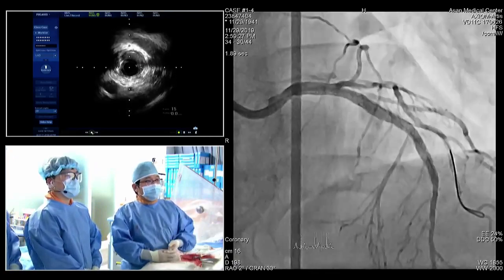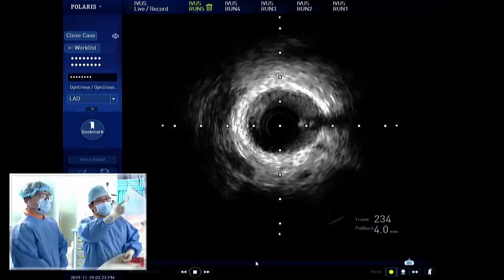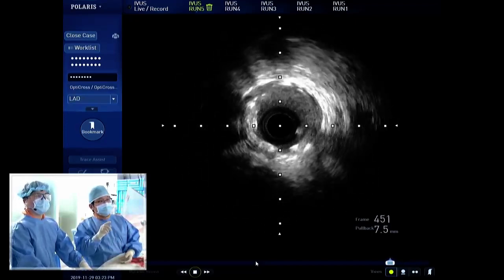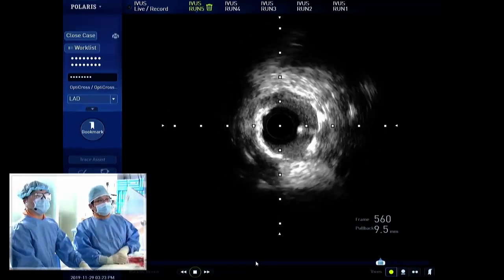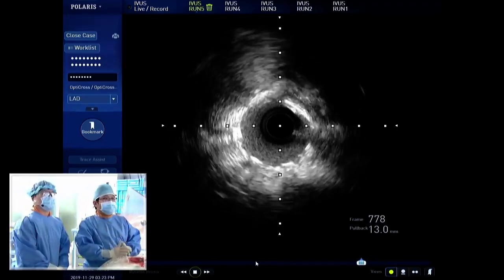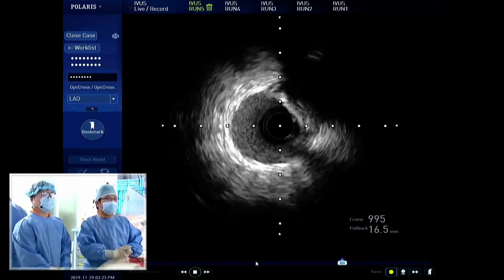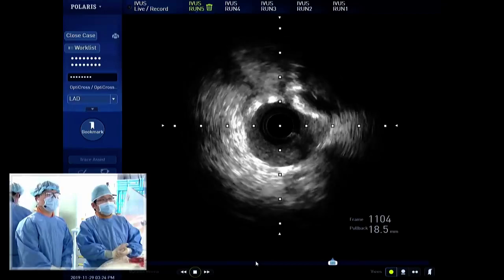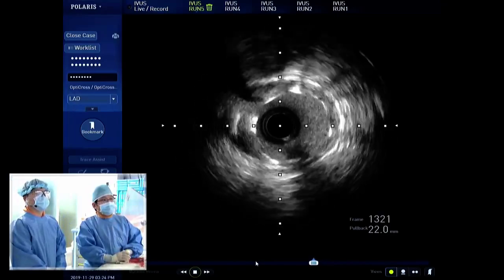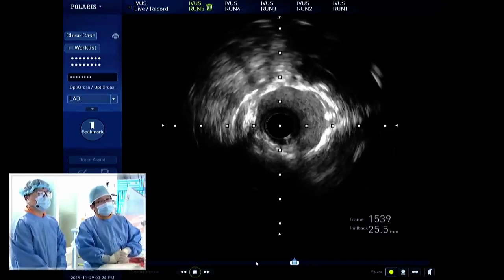All right. Compared with the baseline angiogram, the vessel is getting bigger, and IVUS shows, can you see the IVUS? Here is the distal landing. Yes, based on the IVUS finding, we used 2.5, so the stent was implanted fine, with the stent distal on the very minimal plaque area. The lumen is a little bit small, but considering the vessel size, I think this stent area would be fine. There is some eccentric stent expansion, but this is due to the very heavy calcification. Here is below the diagonal branch. The diagonal branch is coming, and then the vessel is getting bigger up to 3.0.